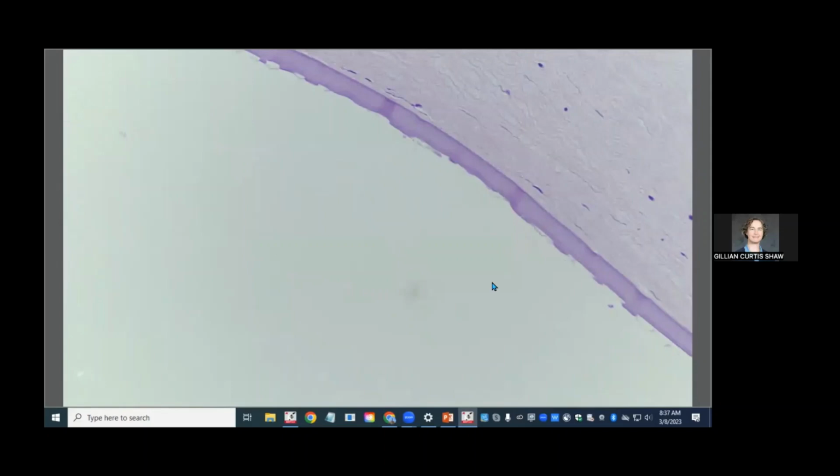It's just corneal edema, so it's clinically managed until either the animal dies, like in this case, or there's a secondary lesion, which makes it really hard for us to make the diagnosis. What usually happens from a pathology standpoint is they have corneal edema, then ulcers, then secondary corneal disease. By the time you receive it, it's so chronic that you can't even make the main diagnosis.